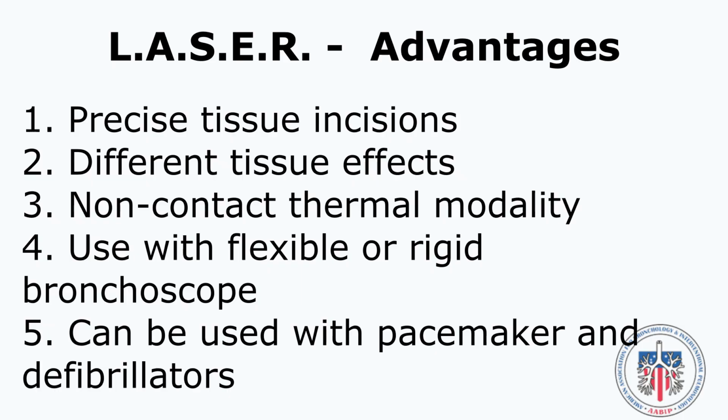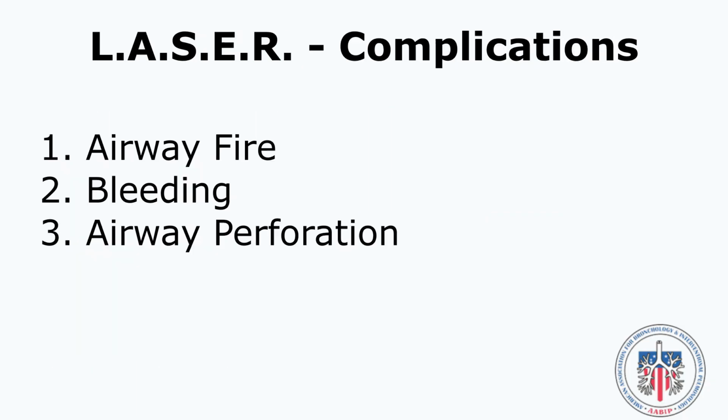Some of the advantages of laser therapy are the ability to conduct a more precise tissue incision in the airway. It offers a variety of tissue effects. It is a non-contact thermal modality and therefore can be used from a distance. It can be conducted through both a flexible and a rigid bronchoscope, and it does not usually interfere with pacemaker and defibrillator devices. Some complications of laser include airway fire, bleeding, and airway perforation.